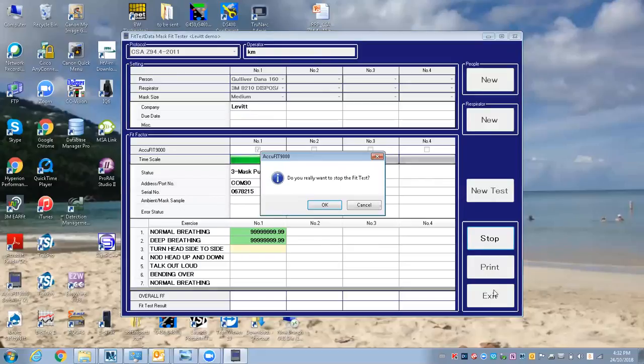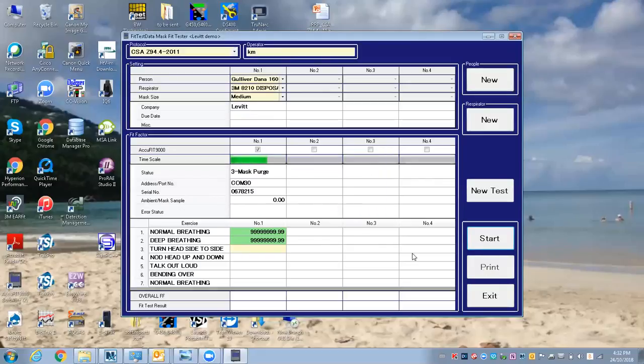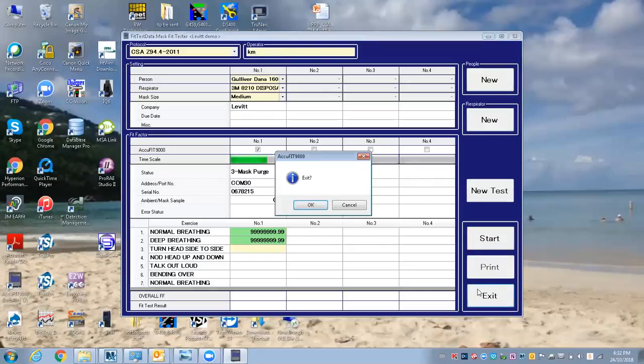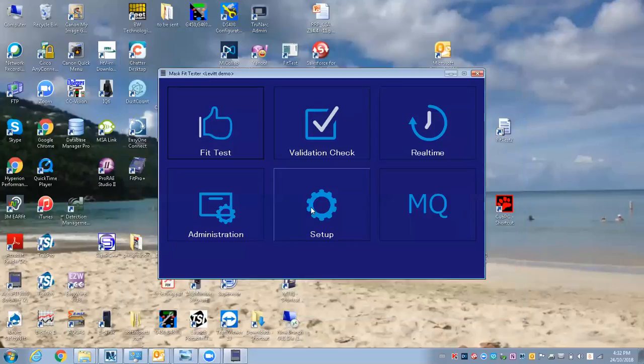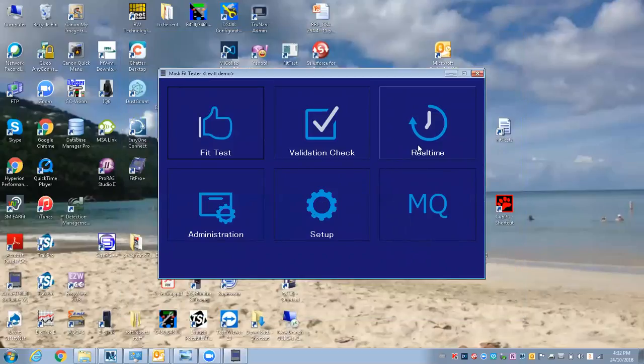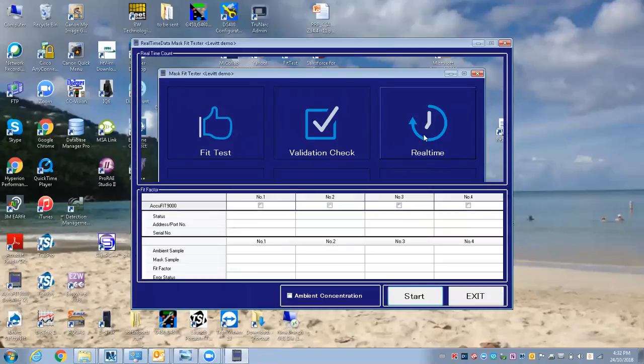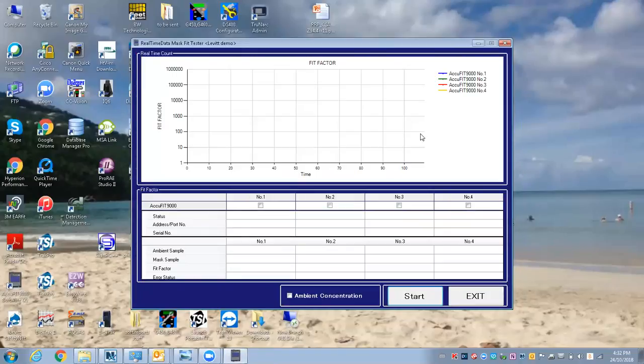I'm going to stop this, and I can also have a real-time mode. If you're having problems getting a mask to fit, you can do this.